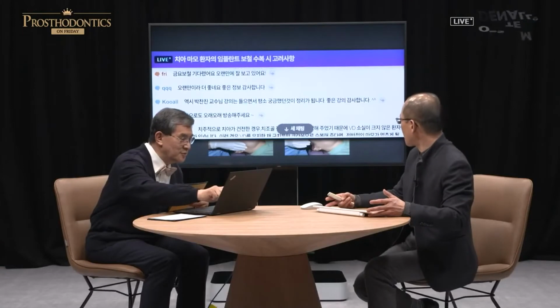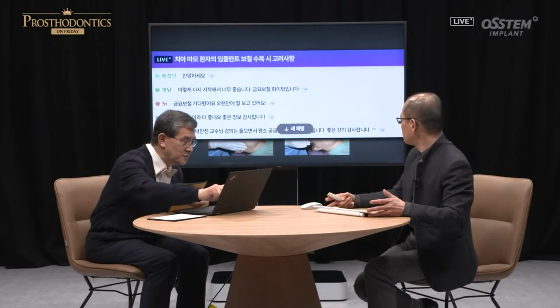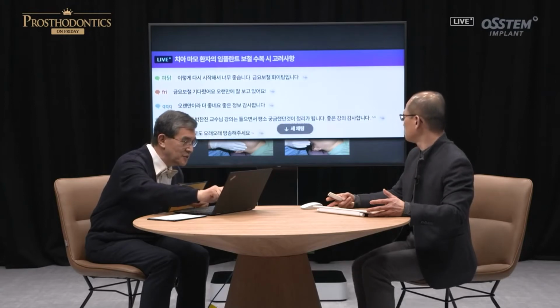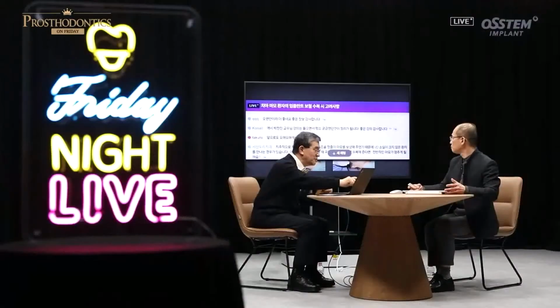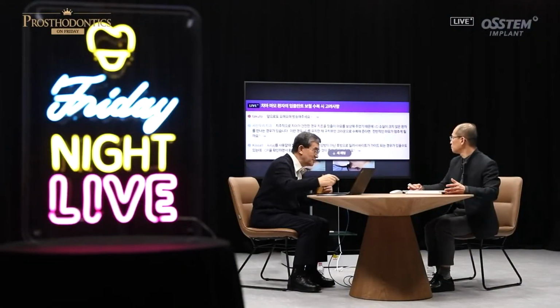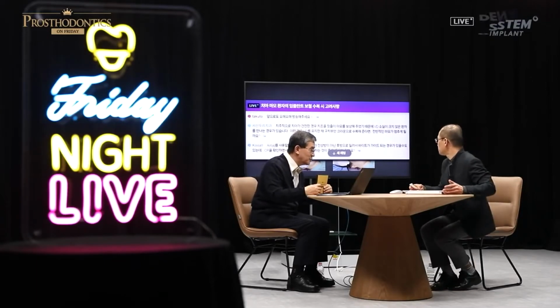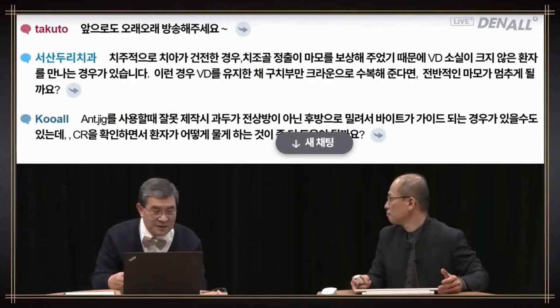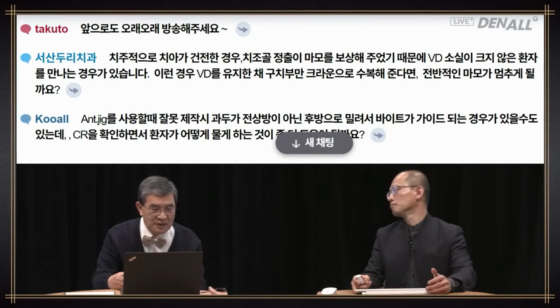Thank you. I think Duri Clinic and Friday, other people have all made comments. And another person said, please keep the series going. And there's another question here from Kuo. It says, when using an anterior jig, if you don't make it correctly, it can be pushed toward the backside, guiding the bite that way.